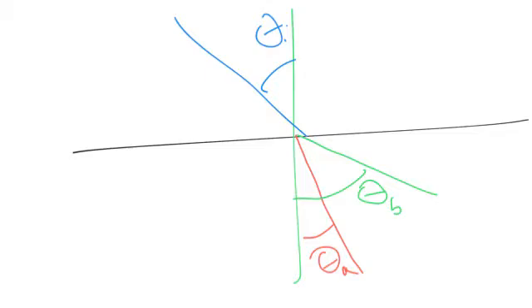Okay? So here we have obstetrical ultrasound with a fetal head, and you can see these portions of loss of sound coming off of this fetal head because the bone is really hard compared to the soft tissues around it. And so what does that tell you? It tells you that there's a big difference in speed of sound between the bone and the soft tissue. So when the sound hits that bone, it's refracted a lot, and it just disappears. Okay?